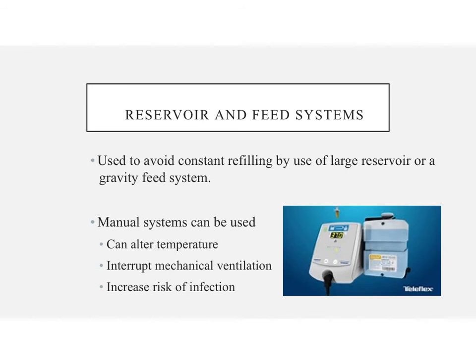So when you are changing this, you're not disconnecting the patient circuit, because that's attached up here to the top of the humidifier. You are not having to interrupt ventilation to change out the gravity fed system, so these are not going to pose an infection risk. That small inlet is added to the reservoir, and a gravity fed water bag or container such as this allows refilling without interruption of ventilation. It's not going to change the heat. It's not going to cool down that water vapor.